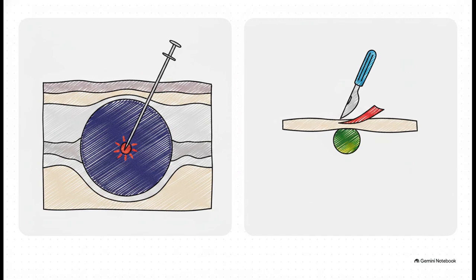On the one hand, we've got EUS-guided fine needle biopsy, or EUS-FNB. With an 84.2% diagnostic yield, it is phenomenal for larger lesions. It gets you that crucial core tissue for immunohistochemistry and mitotic index for GISTs. But what if the lesion's tiny? Under 20 millimeters, needles tend to deflect or just completely miss because the lesion rolls away. That is exactly where MIAB, or mucosal incision-assisted biopsy, comes into play. It has a stellar 88.2% yield.